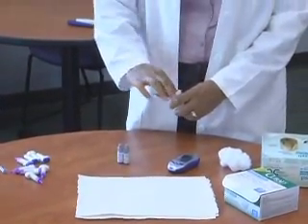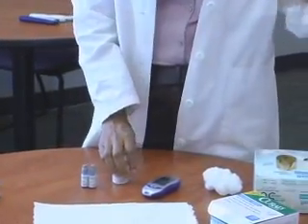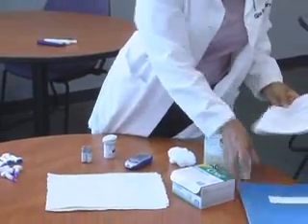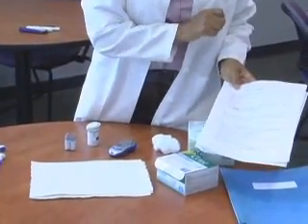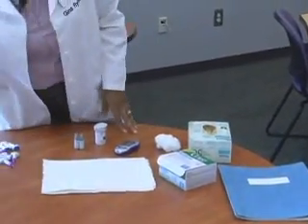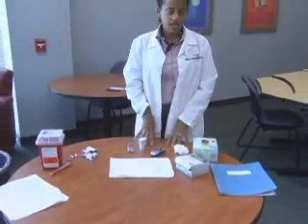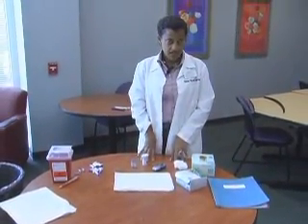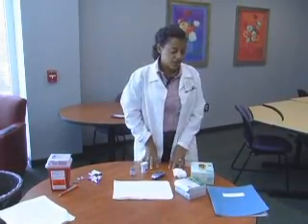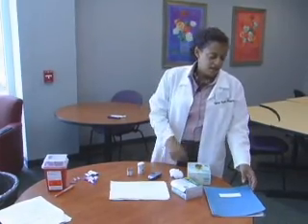What I usually do is have the patient come up, sit down, and fill out the necessary paperwork — a consent form that they fill out and sign. I will ask them if they know that they have diabetes. If they have diabetes, they cannot be screened. If they have diabetes, you are not to test their blood sugar — that disqualifies them from participating in our screening program.